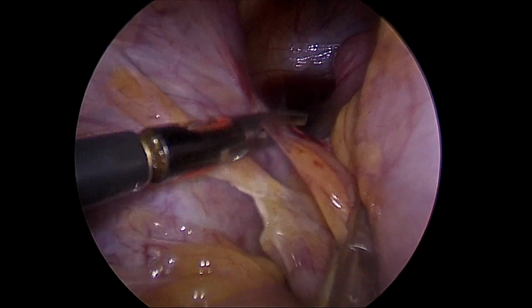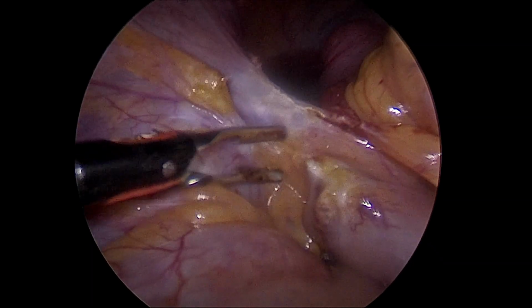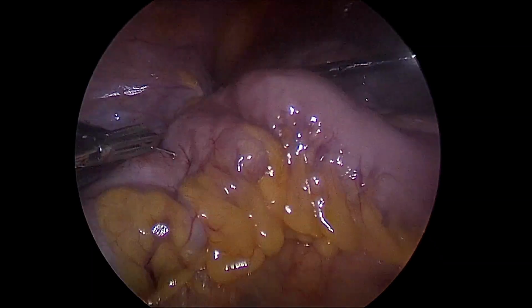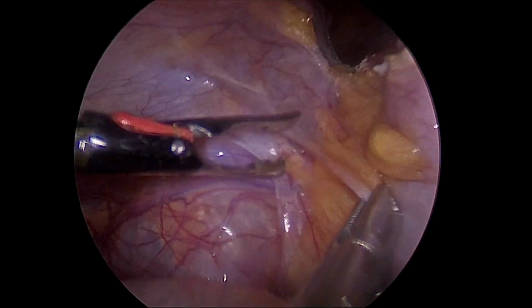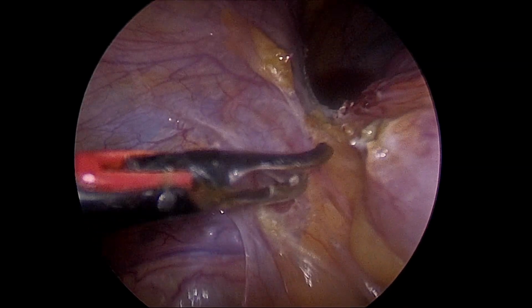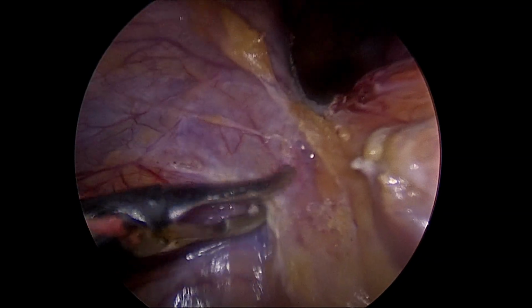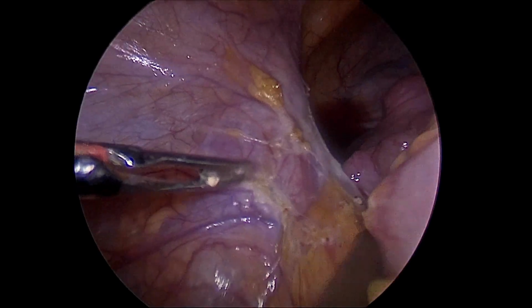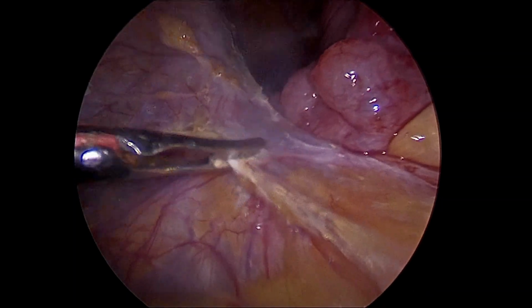First step that remains is to separate and dissect the bowel from the left lateral pelvic wall, the sigmoid colon. This will ensure that the bowel goes up well and it does not keep on falling into the pelvic cavity and the POD remains clean. I use a bipolar shearer for this particular job and it works very well.